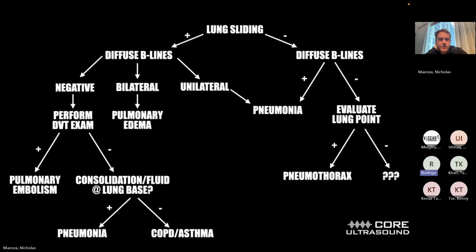I was going to ask you, if you got the story, the physical exam, and these images, and you're sure it's a pneumonia, would you still do the X-ray in the ED? No, not necessarily. I will say it's common practice to do one, partially because it's very easy, and this is more of a management question. Everyone comes in through triage and gets advanced triage, and part of the advanced triage for whatever sick symptoms they have is getting a chest X-ray. That's almost like a workflow issue.